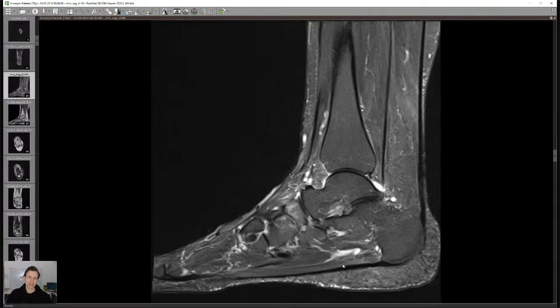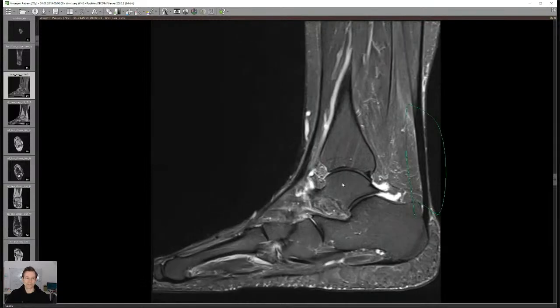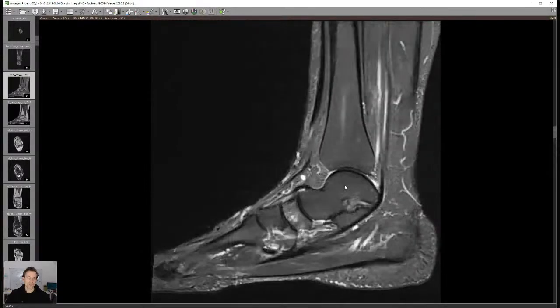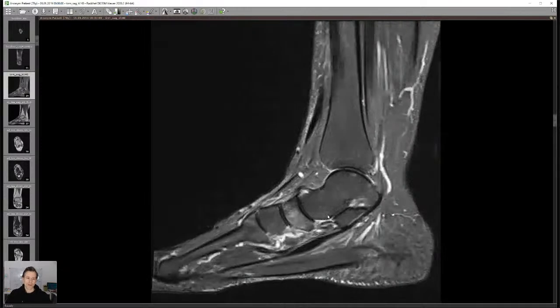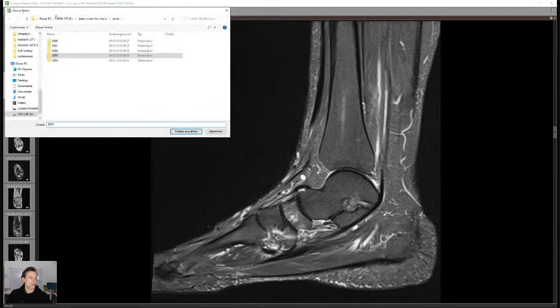For me, a tendon doesn't only have to show different signal — it also has to be thickened. Little signal alterations alone aren't enough. That's especially true in the shoulder — people always call supraspinatus tendinopathy when I think it's still within normal limits. Always ask yourself: if you call this tendinopathy in a 70-year-old with an otherwise reasonable tendon, is that really meaningful?